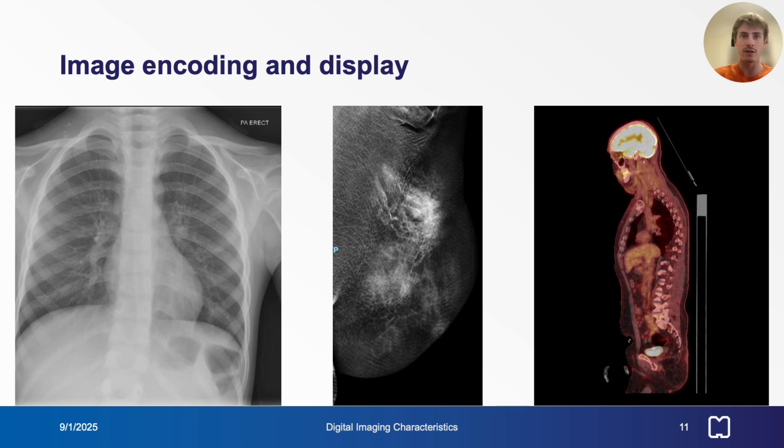In consumer applications, images from digital cameras are usually 8 bits per channel and encoded with 3 channels of red, green, and blue true color information. Medical imaging applications often involve single channels of information representing a single physical quantity, such as X-ray density, and are visualized as grayscale images. These may be encoded such that lower numerical values are displayed as either dark or light. If color is applied to such single-channel images, it is an artificial pseudo-color palette intended to make subtle differences in intensity more visually apparent.